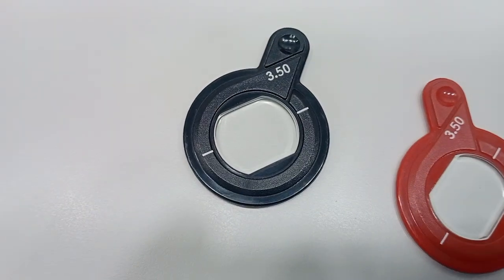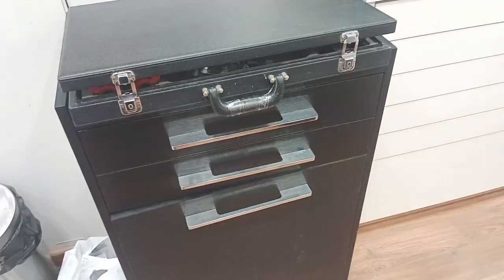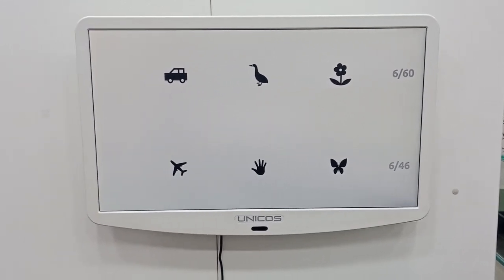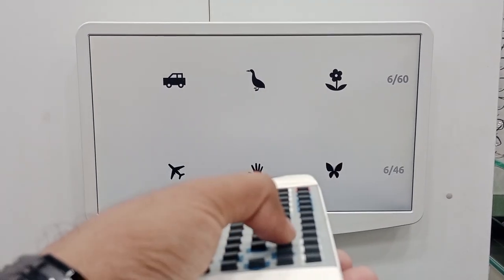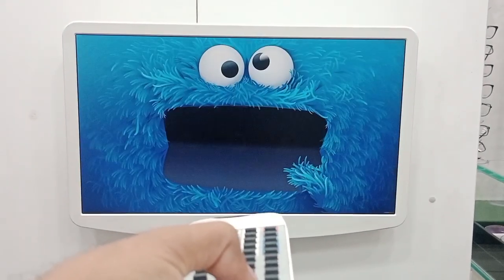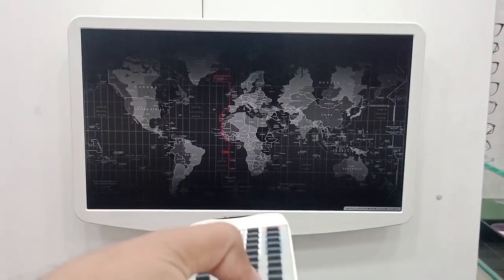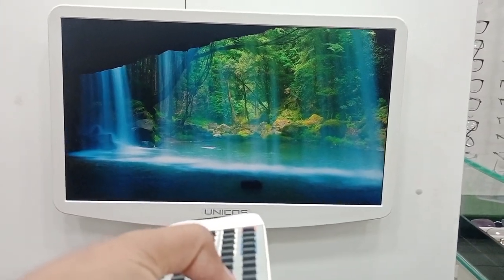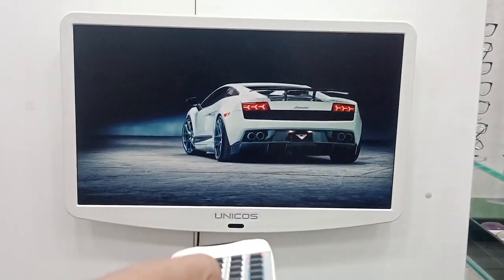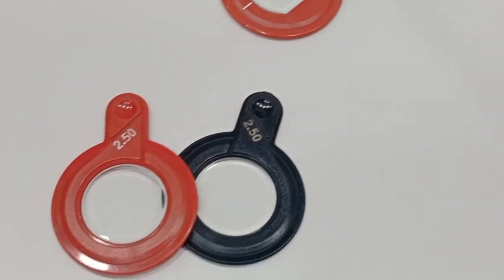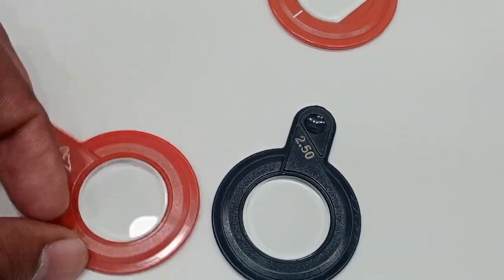So we have minus spherical, plus spherical, minus cylindrical, and plus cylindrical lenses. Now let's select a target on the screen. We have a dragon, different colors, a squinted cartoon, a map, natural beauty, and a car — I'll pick the car as our target.